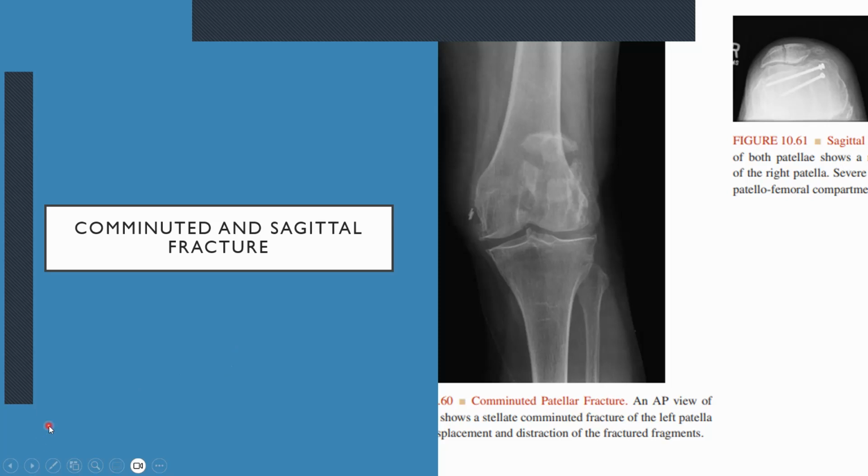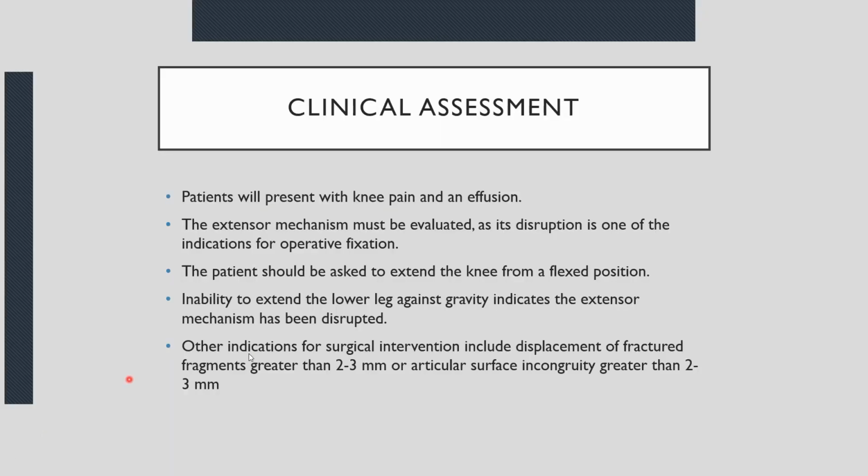It's not very rare, but you've got to have a look at everything. Don't just look at the patella itself. But isolated patella injuries do happen, of course. Okay, so what do we find on clinical assessment?